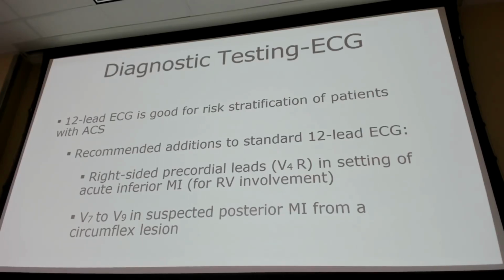So we already talked about this. Our 12-lead EKG is great. Think about the right-sided EKG, V4R, or your posterior EKG, depending on what the presentation is or what the initial EKG shows you.